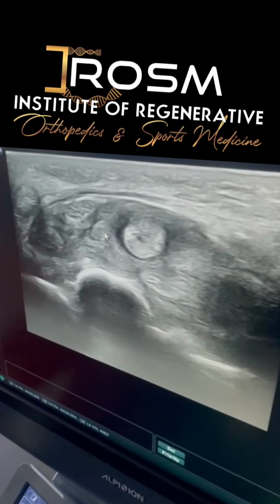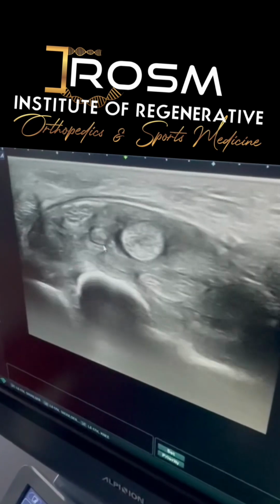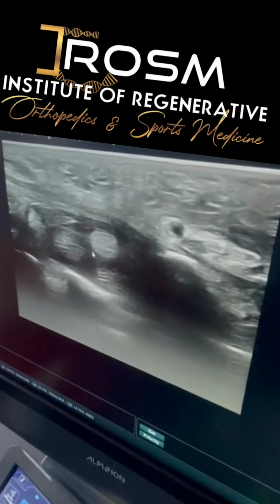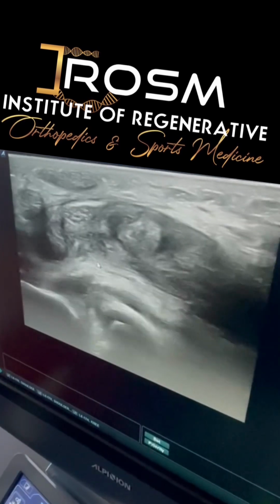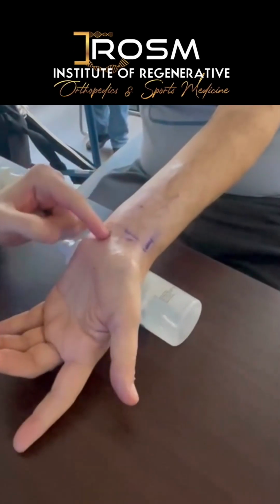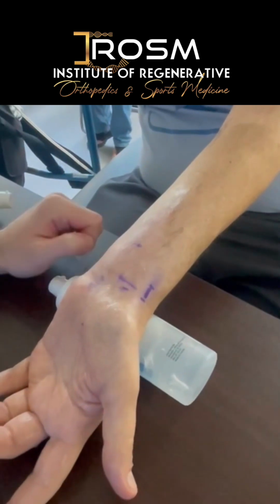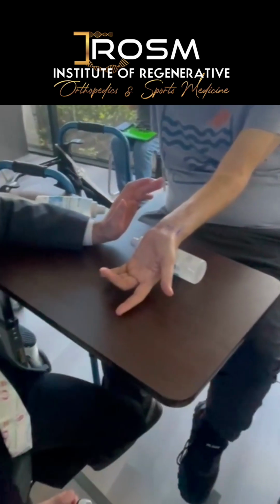Here it came back. Again, I'm going to now scan proximally, and it goes away. Back and forth, you can see it there. And even once I come here, I am able to flex it, and I still see some motion. Obviously, once I get past the tear, there it went away. There's no more movement of the muscle. So, come back here, and I made some marks here. Essentially, it's right at the level proximal to the carpal tunnel, right at the level of the lunate, where I'm able to see that disconnect, at least of the flexor tendon. Thank you for stopping now.